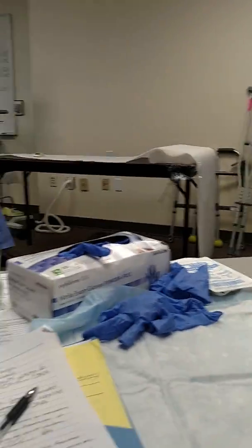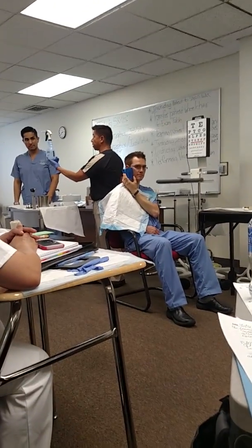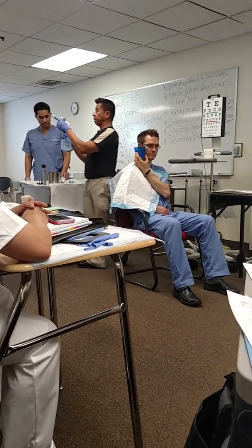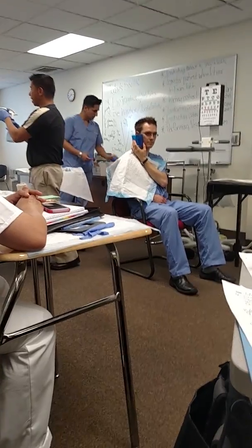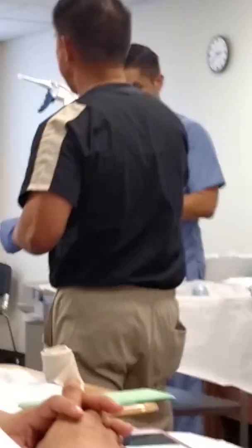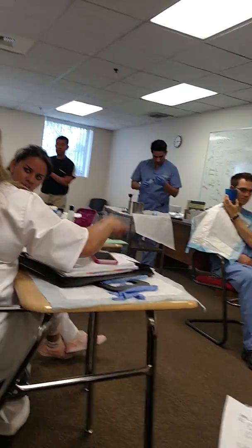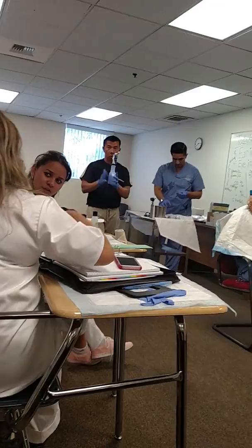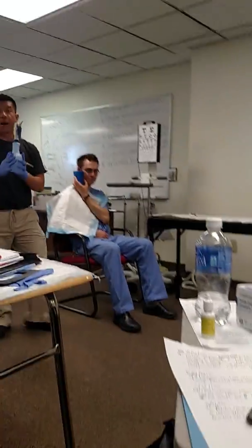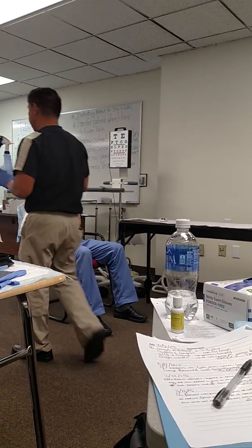And there are different devices they use in the clinic. This is commonly like the auto clear spray ones that they use in the clinic. You have to see the little tube, and that will be inserted into the ear canal. You guys with me? Yes. And not all of them. So, want to make sure that the water or whatever fluid you're using is per the doctor's order, and it's at room temperature or body temperature. You don't want to wash the patient's ear with a cold temperature.